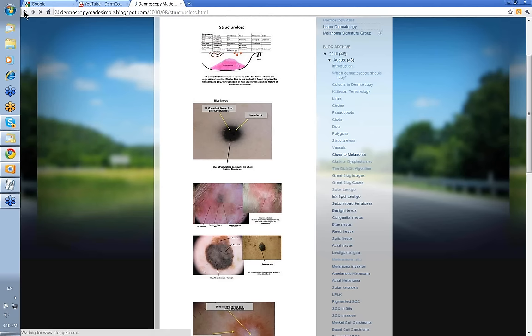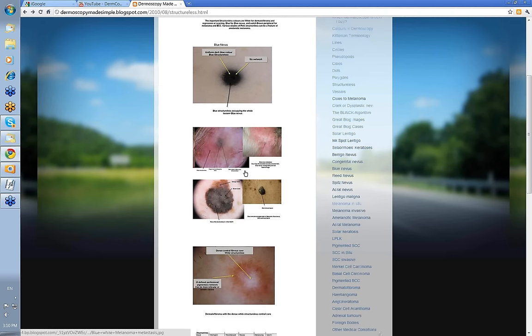Those are the main blue ones. I should have included perhaps a thick pigmented basal cell skin cancer as well, because sometimes they can be very uniformly blue.